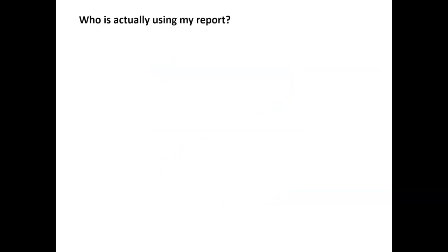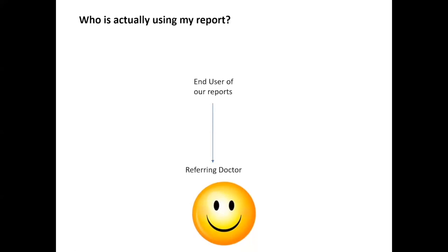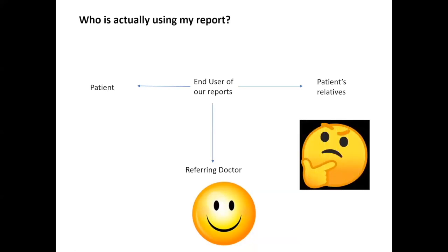So whenever I release my report, the concern is who is actually using my report, who is my end user. If it is a referring doctor, I am happy because he understands quite a lot of what I have written in it, what exactly the values mean. But nowadays the problem is the end user becomes the patient or the patient's relative, and that is a kind of worry to me. Why?